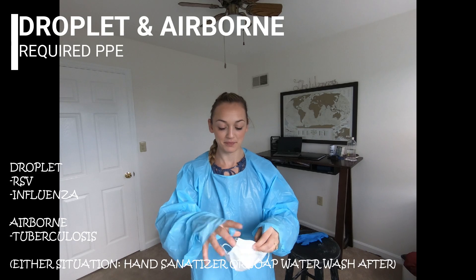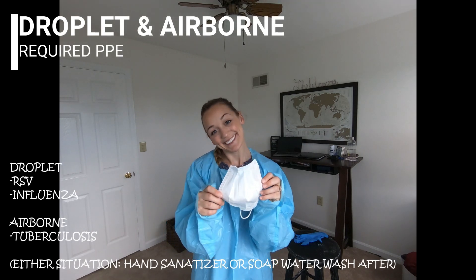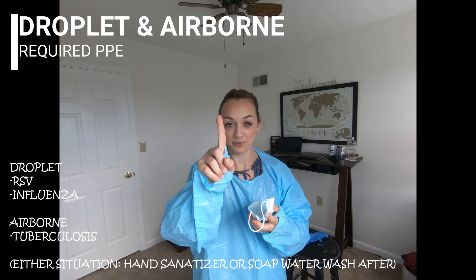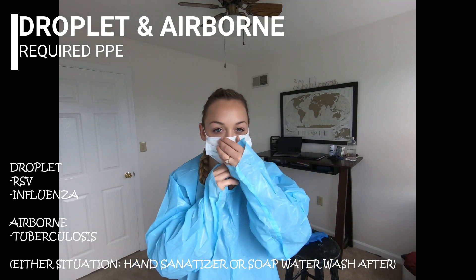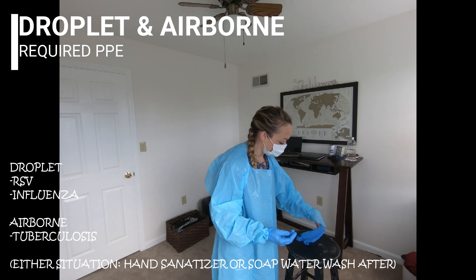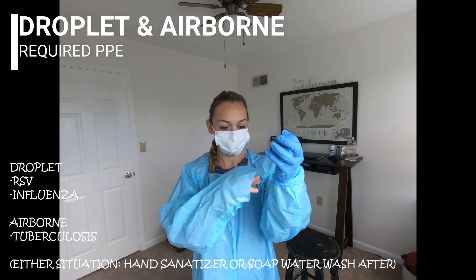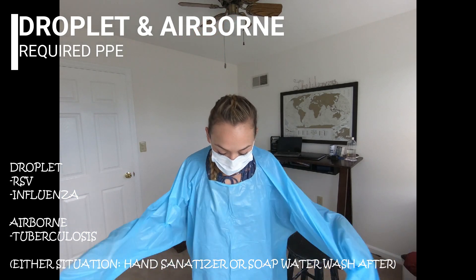Airborne precautions require an N95 mask, which comes in two forms: the normal round one or a duckbill. You would take it and pull the first strap over your head so it sits at the top of your head. Second, pull the lower strap to hit the back of your head at the lower nape of your neck. Then put your gloves on — always put your gloves on last. For the N95, you must be properly fit tested, which your employer will do. You cannot go into an airborne room without being tested first.